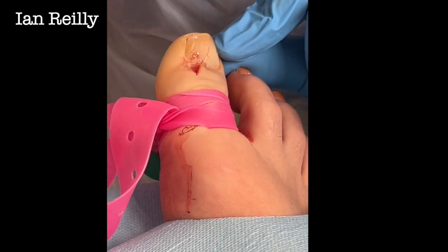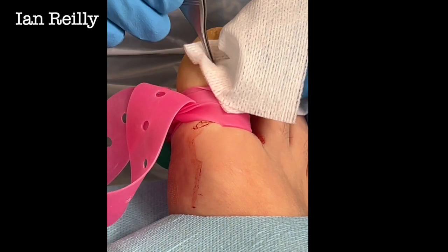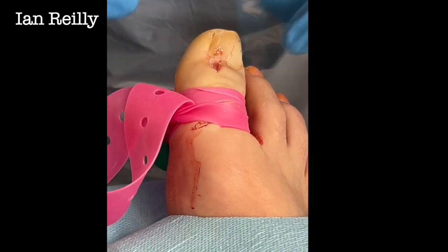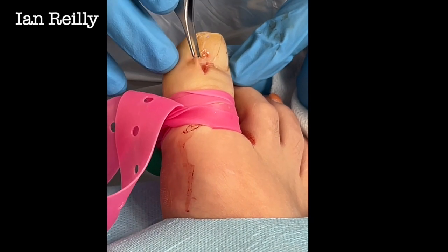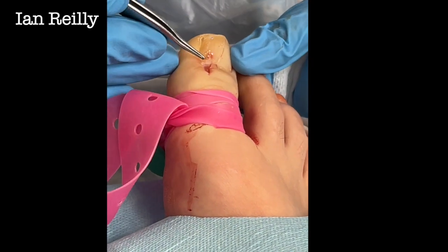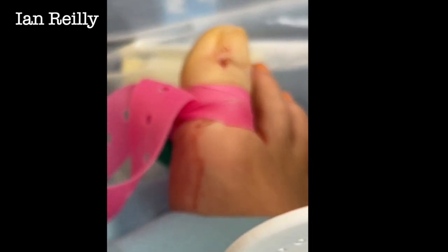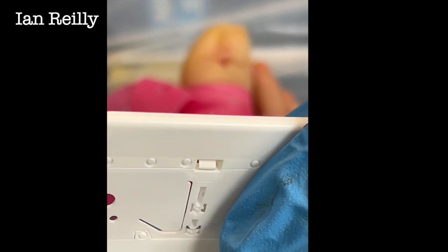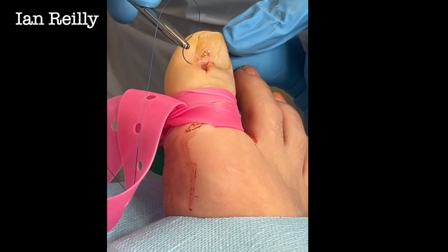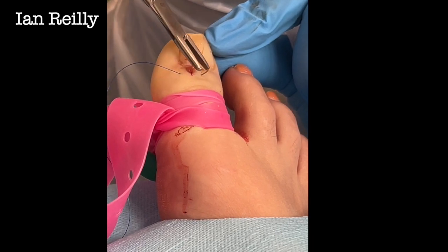I'm just going to scrape the bits there and give it a little clear out, then put a couple of stitches in just to hold it and check any of those little bits that look a bit suspicious. That's it all out now. I'm going to put a stitch in there — that lesion has created quite a hole in the nail. We'll have to see how well that nail grows again with time; it might always be a bit traumatised. But the main thing is for this not to grow back.